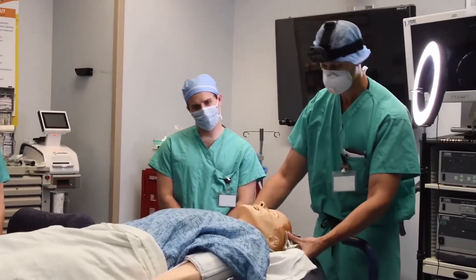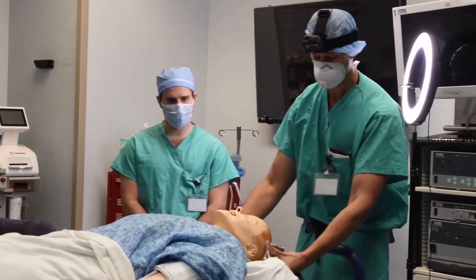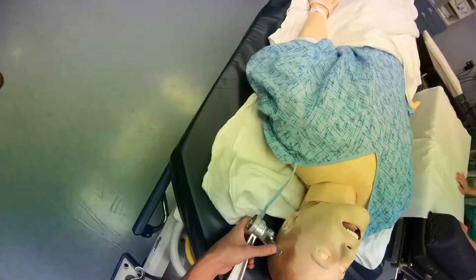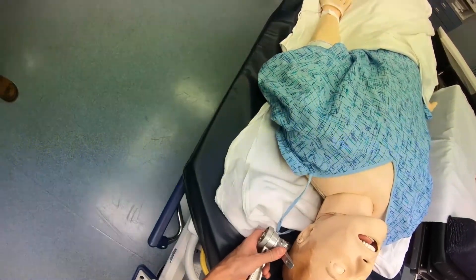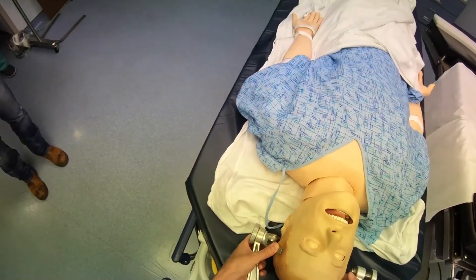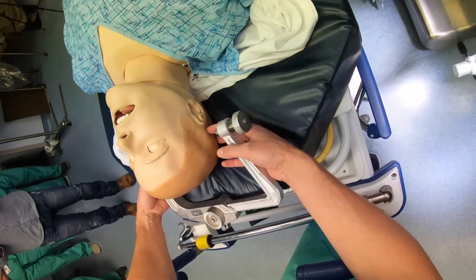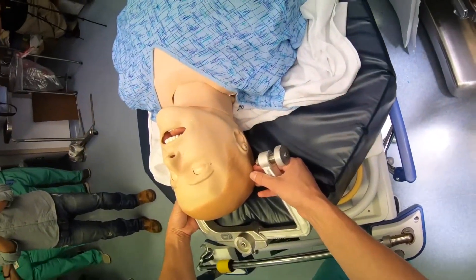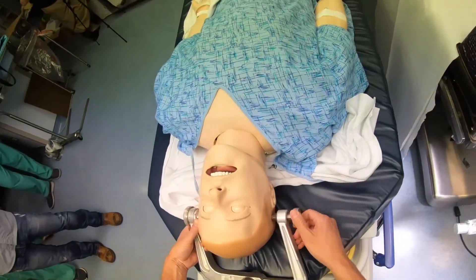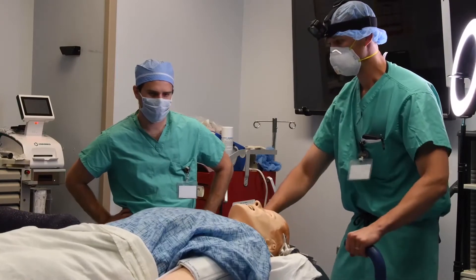You want to make sure that your pens are low enough to be along the meridian, or where you would normally use a sweatband around the head, but also high enough to where they're not along the thinnest part of the temporal bone. A good rule of thumb is on your two-pin side, getting one a little bit farther back towards solid temporal bone or occipital bone, and then one up a little bit higher. On your single side, keep it directly above the pinna — that keeps you from getting into the thinnest part of that temporal bone. Go in and tighten down to 60 pounds of pressure, then get the patient moved over and lined up at the bed.